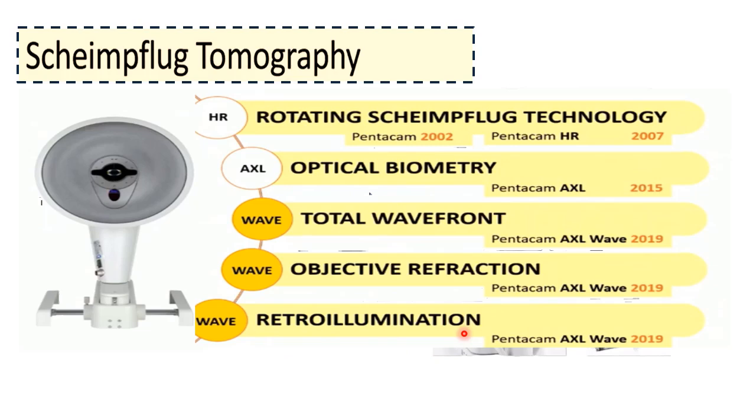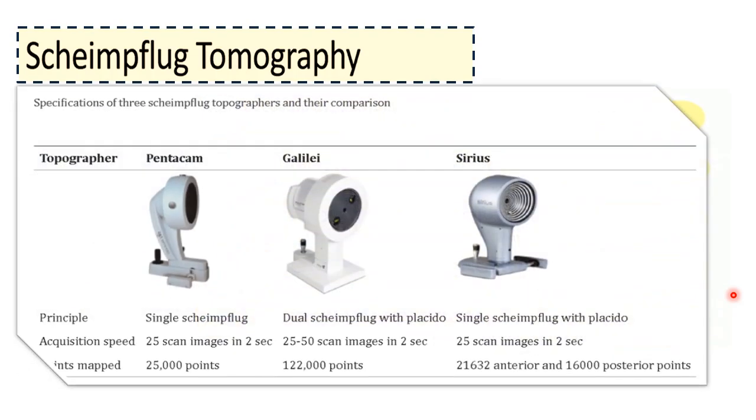So the Pentacam is the new trend, since 2002 till now, the most common Scheimpflug tomography available in the market. However, there are other systems which are using the same principles and even sometimes give a higher resolution as compared to the Pentacam.